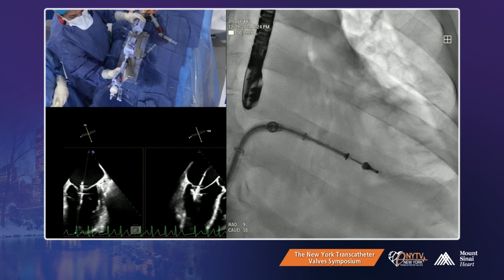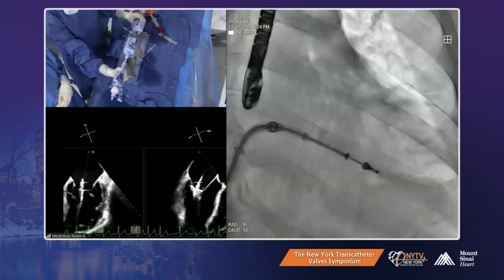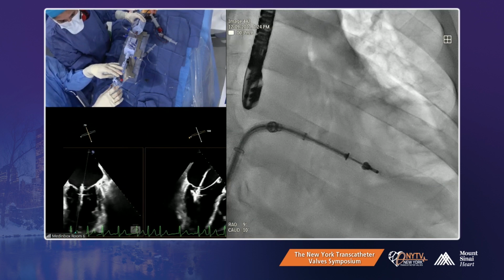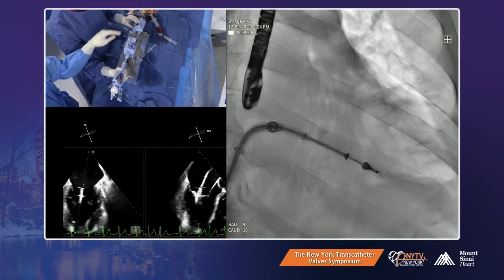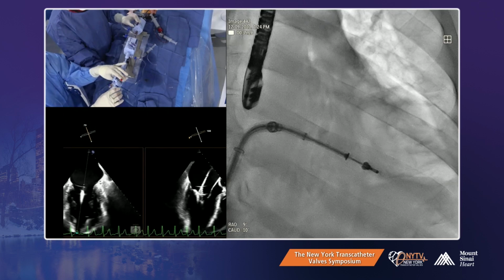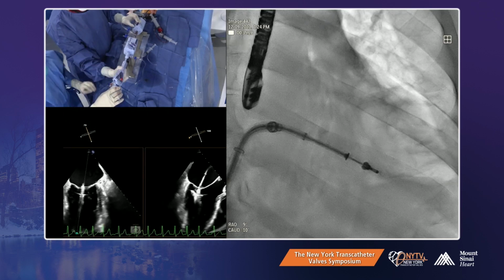Let's keep buckling. You know, I wonder whether it's the cords, the separate cords. Okay. I think we can try that.